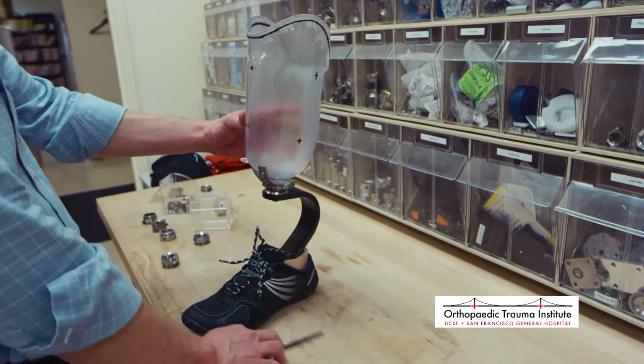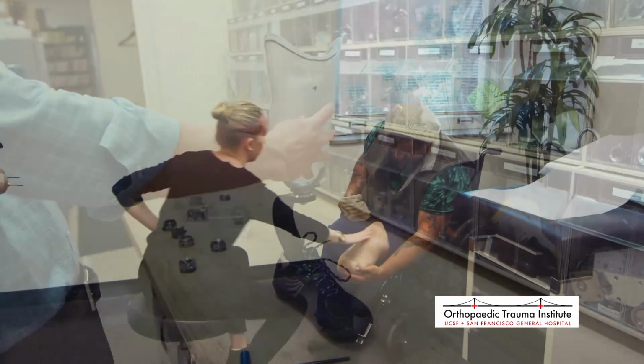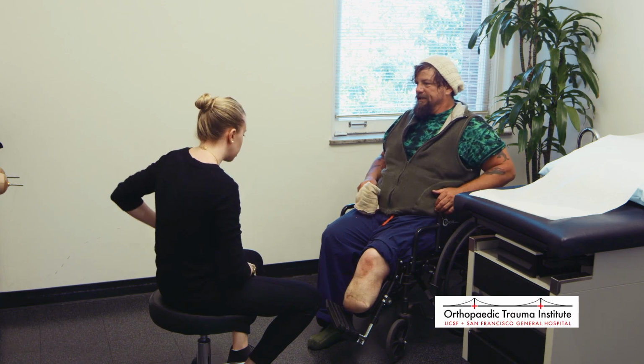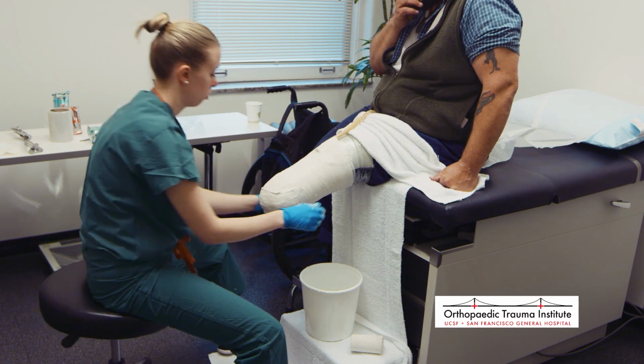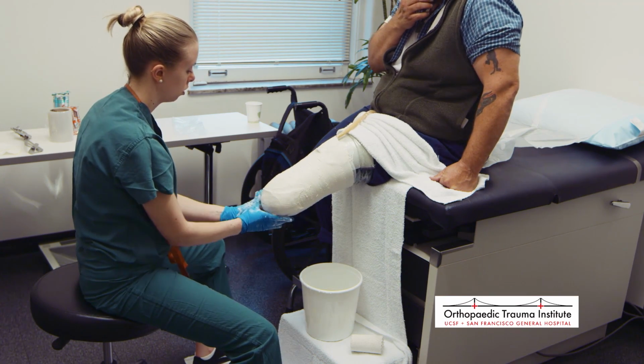Now that you've had a look at how a prosthetic limb is created, let's take a closer look at what the experience is like from the patient's perspective. One of the first steps in creating a prosthetic limb is casting the patient's residual limb to create the test socket. Here's a closer look at Dawn's casting, with Hannah describing some of the items and equipment that are used in this process.